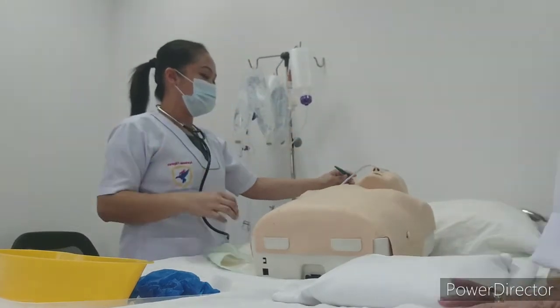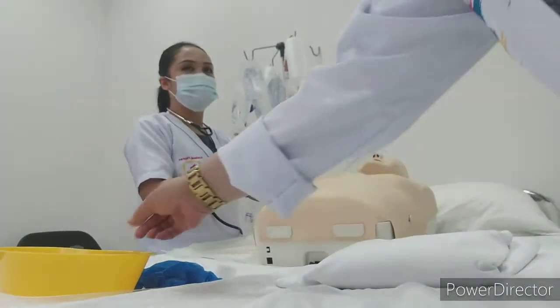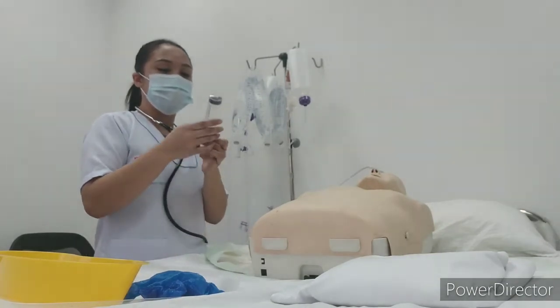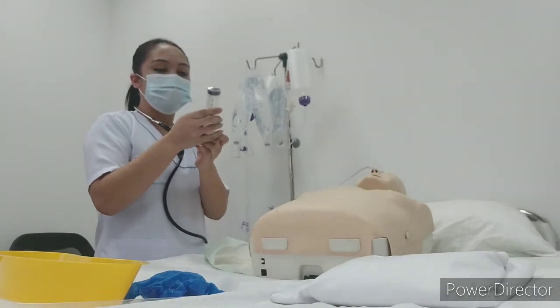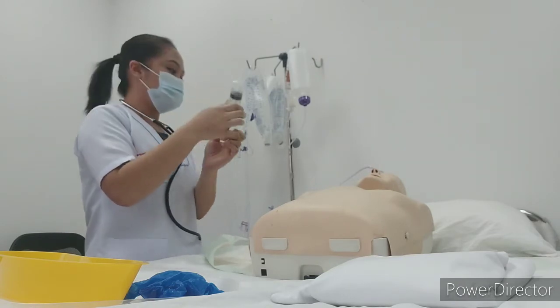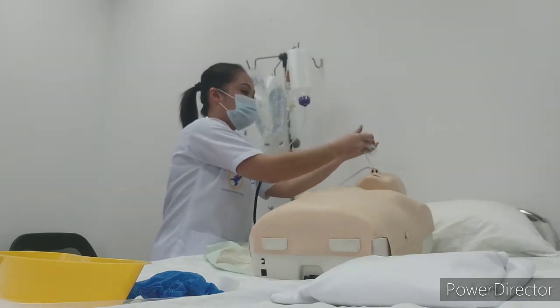Okay, that's it. So now there are 3 steps to check if it's going inside well. We will take the syringe, 20 ml, aspirate 20 of air. This one, pinch, open, and then connect.